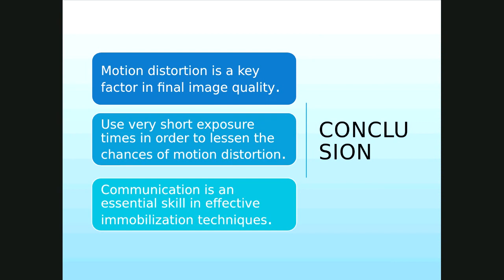You do not want images with motion. The radiologist does not want images with motion, if at all possible. You should not pass images that have motion. If there's motion in the intestines from peristalsis, that is not something you can control. So that would be acceptable in some circumstances.